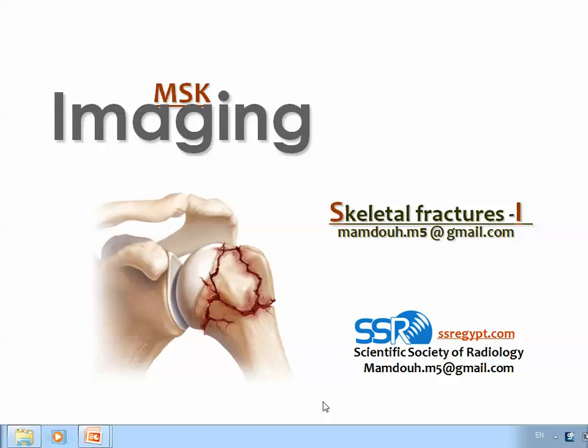Dear colleagues, now we are starting new lectures in the series of musculoskeletal imaging, and we have about 4 lectures about diagnosis of skeletal fractures. And this is a very important topic, as you all know, for both the clinicians and the radiologists. Then we'll go through these lectures, starting first by the upper limb fractures, then we'll go through the lower limb fractures, as well as the types of pelvic fractures.